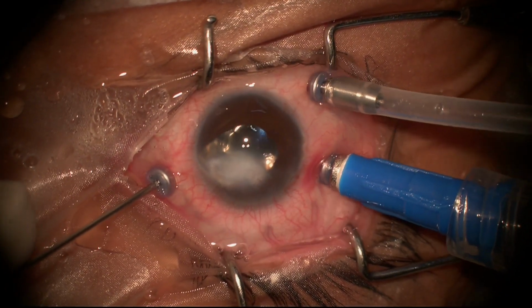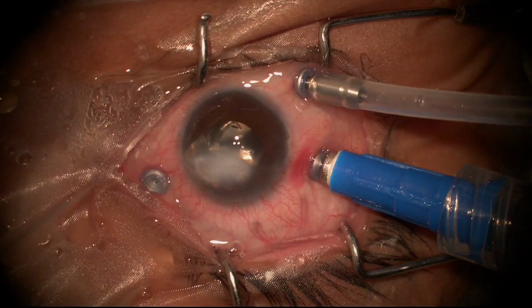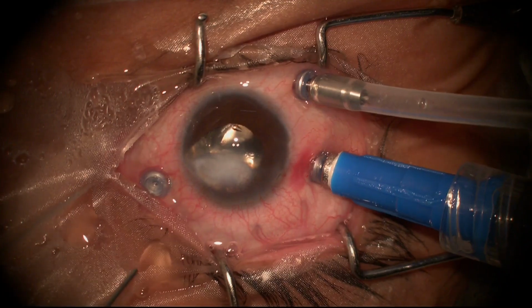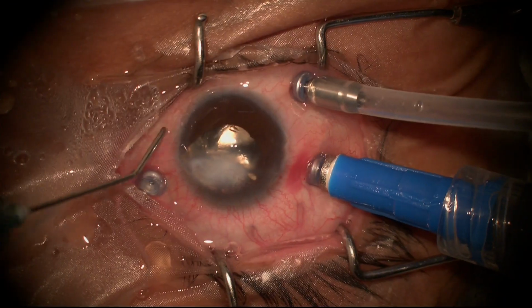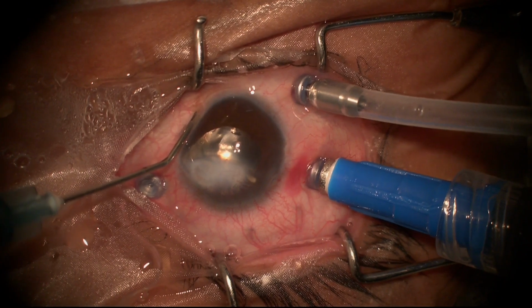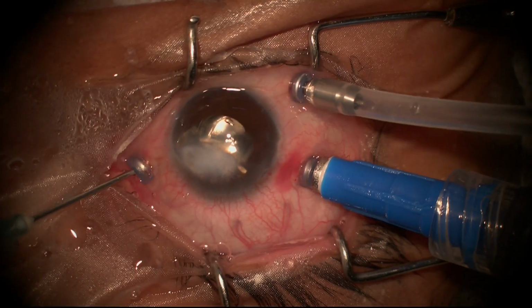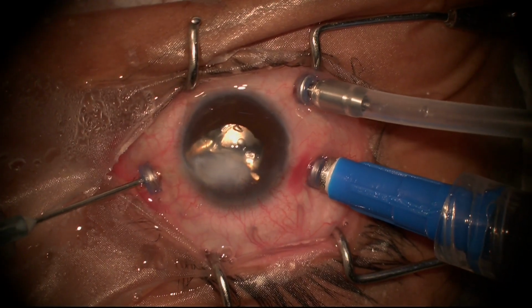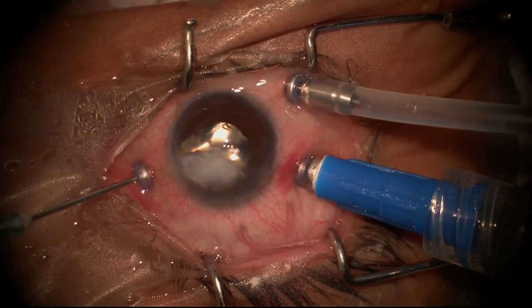When injecting oil, it is not very important that you should have a view, because if you have confirmed that your cannula is in the vitreous cavity, then it doesn't matter now. Keep an eye on the pressure. Or you can also place a cannula inside, and this will siphon off any extra pressure out of the eye. And you can press the globe just to check how is the IOP.